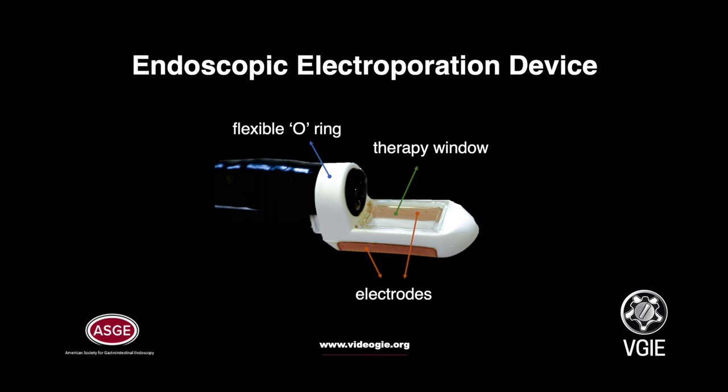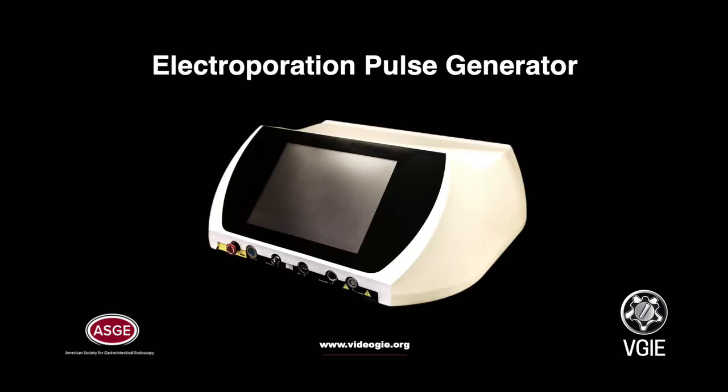The device consists of a flexible O-ring to which the endoscope is attached, a therapy window, and electrodes on the lateral walls of the chamber. The pulse generator delivers a series of pulse bursts of biphasic waves with a frequency of 10 Hz and an electrical field intensity of 1 kV per centimeter.